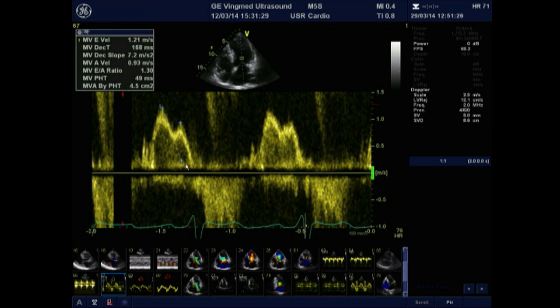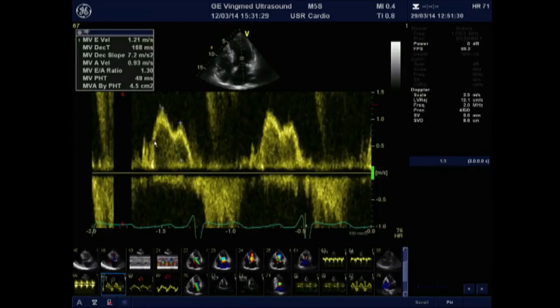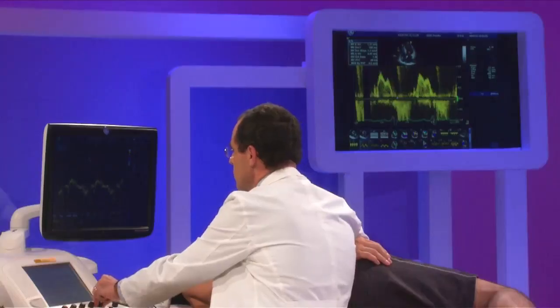Very important, this pattern, the transmitral inflow pattern, specifically in this type of patients, hypertrophic cardiomyopathy patients, does not show good correlations with invasively measured LV filling pressures. So be careful, because you must interpret these patterns, the transmitral inflow pattern, very prudently in these patients.